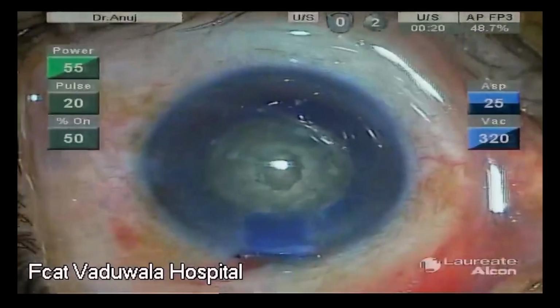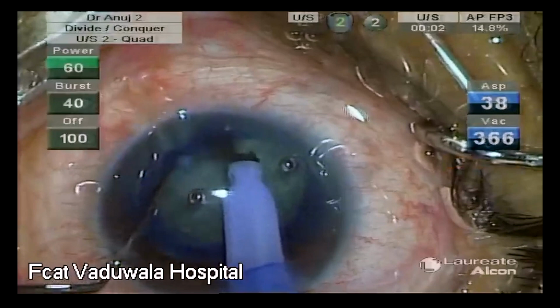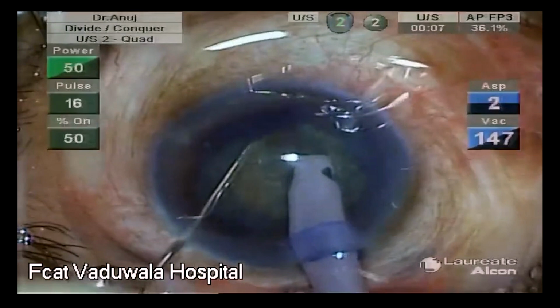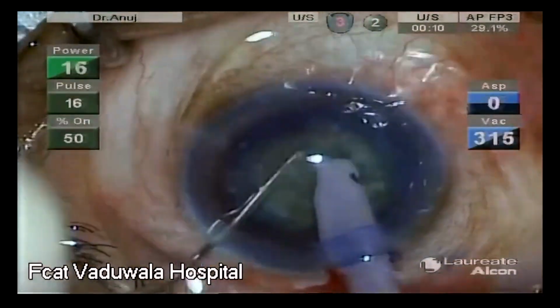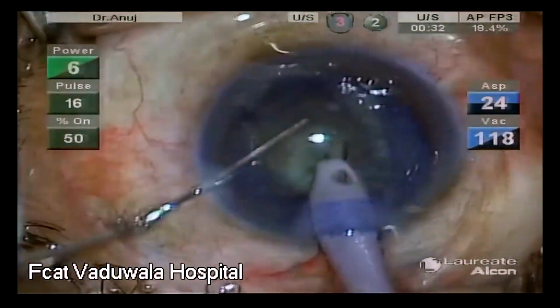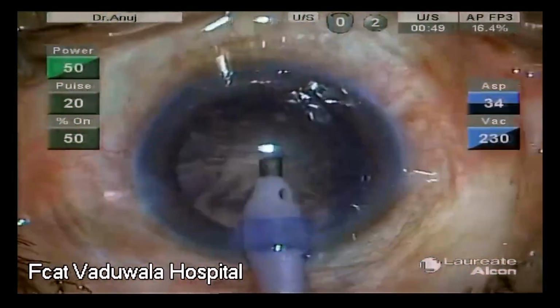The central well should be beyond the center of the nucleus at around 70 to 80% of the depth in order to get a correct angle of impalement. A slight amount of phaco power is applied to bury the exposed tip into the central wall of the well, and the Sinskey, after being placed close to the tip, exerts a force in the opposite direction. We take advantage of the lamellar orientation of the lens fibers, which allows easy manual separation of the natural fracture planes in a dense nucleus.